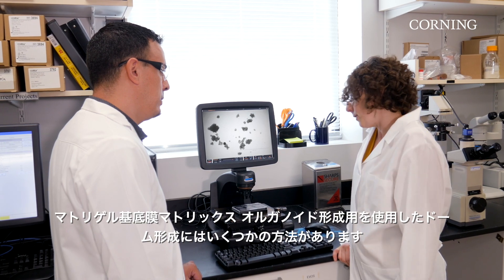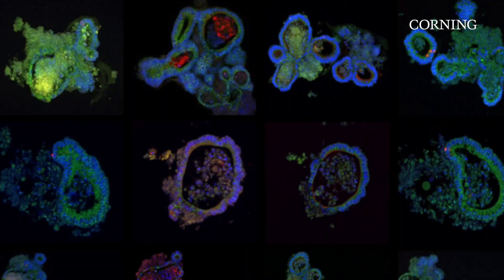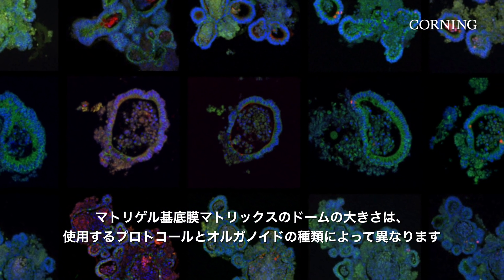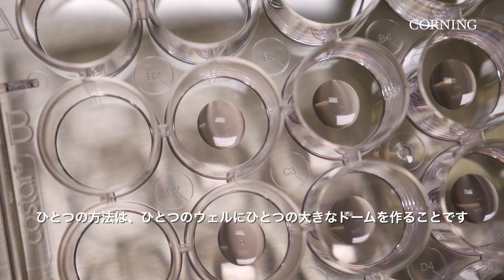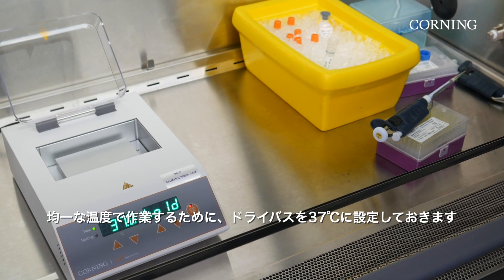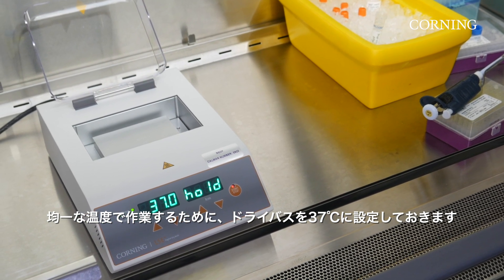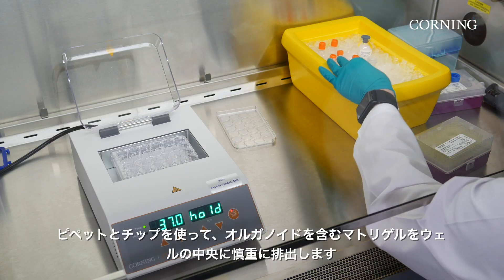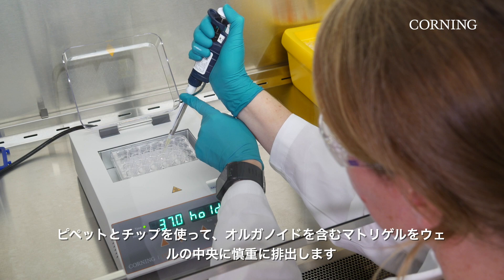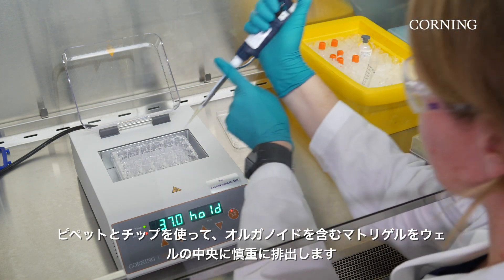There are a few different ways to create domes with Matrigel Matrix for organoid culture. The size of the dome will depend on your protocol and organoid type. One option is to create one larger volume dome per well. With this option, you may use a dry bath set to 37 degrees Celsius to ensure your plate temperature remains consistent while you work. Working with a pipette and tips, carefully dispense droplets of Matrigel Matrix for organoid culture, which includes your organoid mixture, into the middle of the wells.